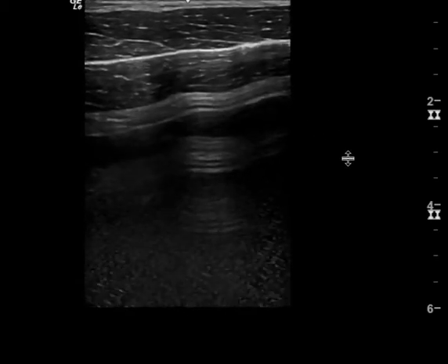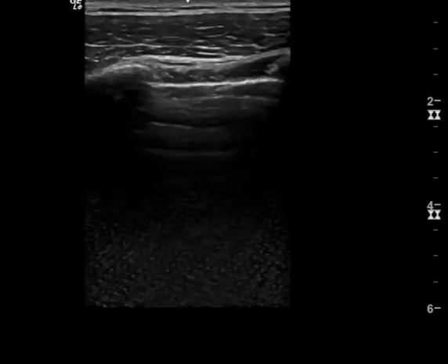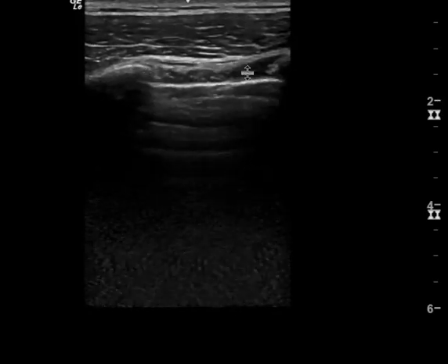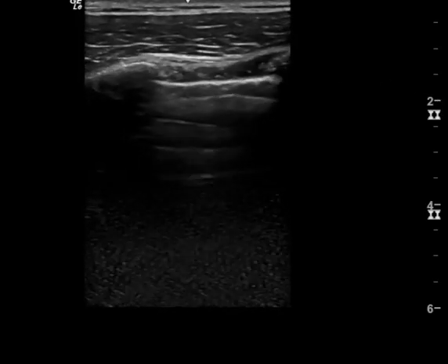And so when you have a complete whiteout of the chest cavity, then this is concerning for subcutaneous air. Another way to think about that, look here. The pleura is 2 centimeters deep. You can see the rib is maybe about 1.75.